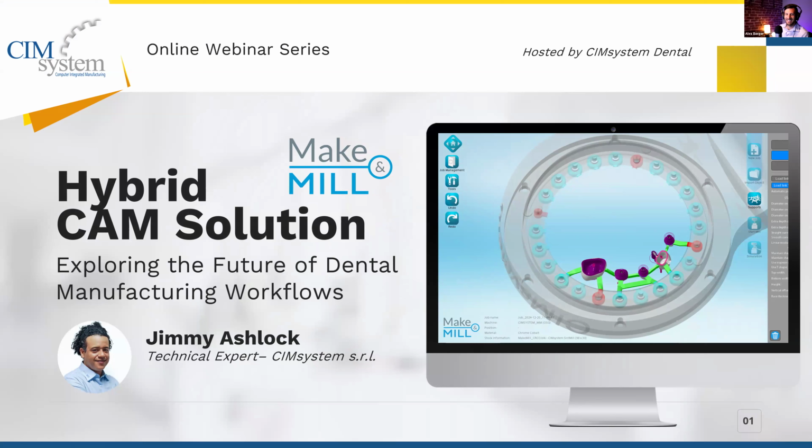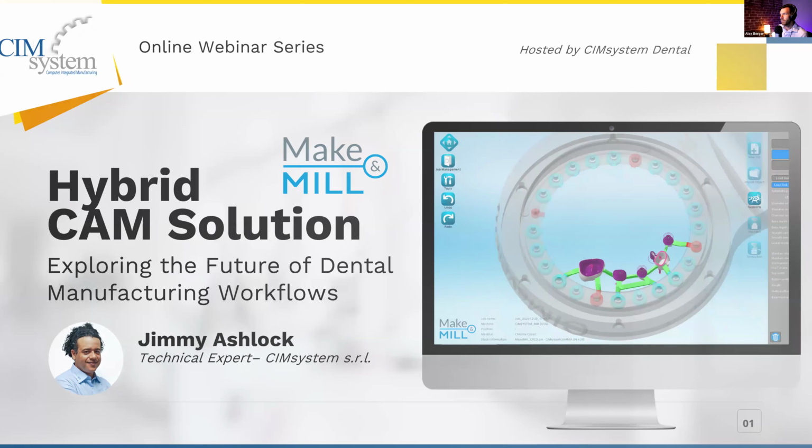Jimmy is a tech expert working with Make&Mill, one of our products here. I'll go over what our products are here in the dental space. Jimmy's been a technician for 3 years. He's lived in both Italy and the US, but is from Italy originally. He is a great technician for us, and helps a lot of people around the world with their Make&Mill technical needs. So we're going to be going over Make&Mill today.